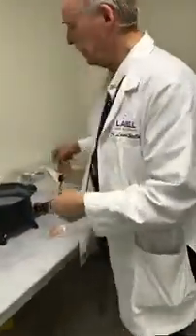Very good. So this is a process that dentists incorporate in their private practices, and you feel like it's a good fit for this type of event as well? It's a perfect fit for this event. It's actually the only process that can be done at this event because the patients are only here one time, for one visit. Dentures typically take 4 to 5 visits, so that's why they have not been done at mom clinics. A lot of dental practitioners in their private offices all over the country do these dentures because of the convenience of one visit and the cost savings for the patient. And it's very profitable for the dentist.